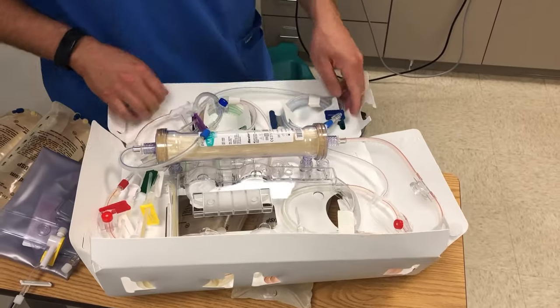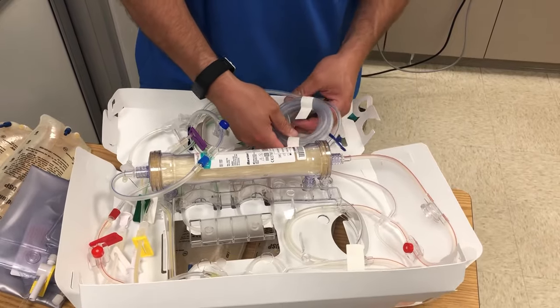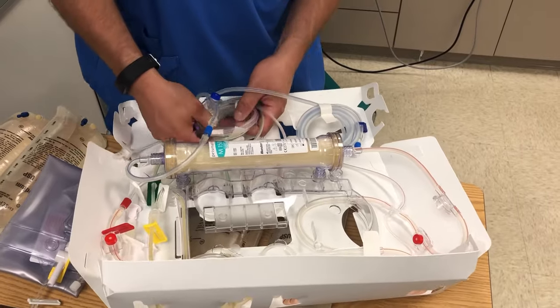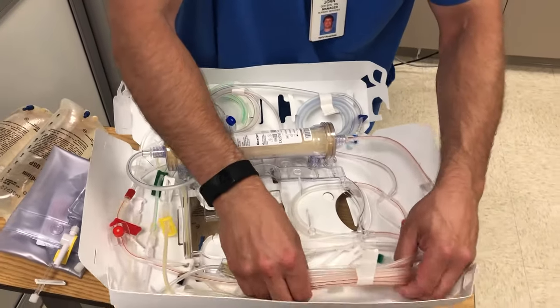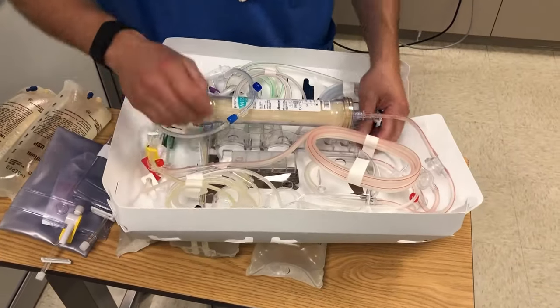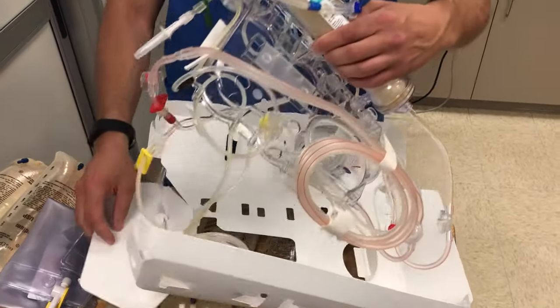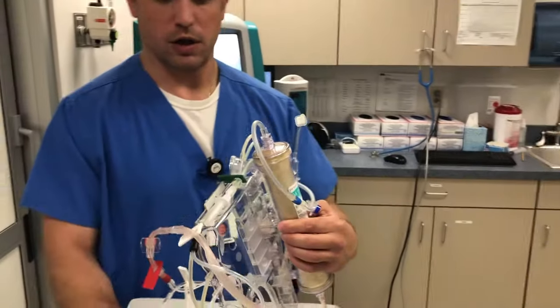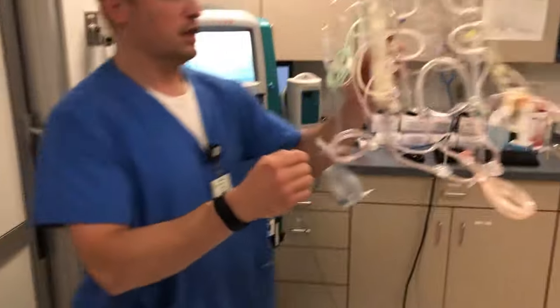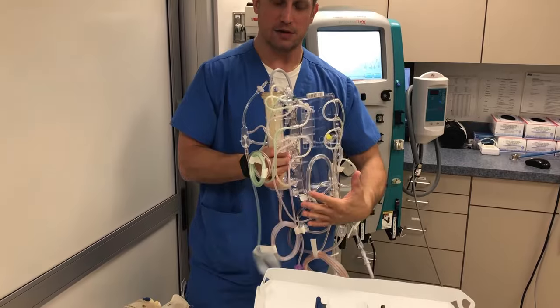When you remove all these loops of tubing out of here, you see that they are taped. You do not want to break any of your tape at this time, because you don't want your tubing to drag on the ground before you connect it to the machine. As you pull the tubing out of the plastic, you can grab it by the filter itself. And you're just going to work on getting the tubing out of the way. And you want to make sure that it's all out from behind the dialyzer.